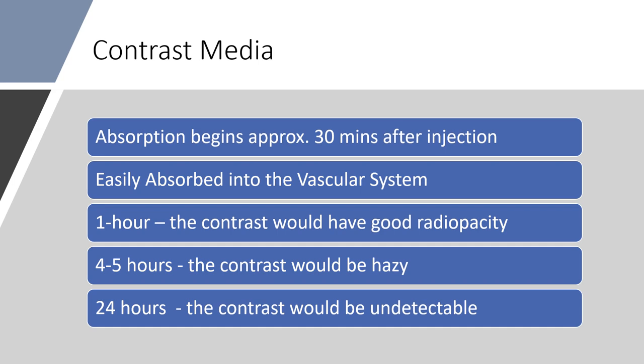At 1 hour, the contrast would have a good radiopacity. From 4 to 5 hours, the contrast starts to get hazy. And at 24 hours, the contrast would be undetectable. So it really goes through your system fast.